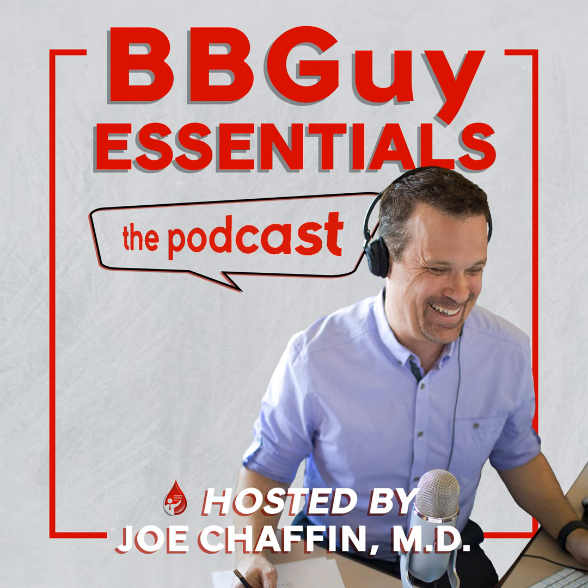But Jill Storry is going to give you a practical approach to distinguish between the three main causes of what we call the panagglutinin pattern. Those three causes are warm autoantibodies, antibodies against high-frequency red cell antigens, and multiple alloantibodies. And she even throws in a quick discussion of the effect of the multiple myeloma drug, daratumumab, at the end of this discussion. I want you to pay really close attention as she describes the basic ways to look at these three main patterns, the ways that we can categorize them.